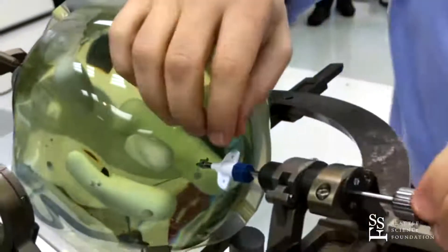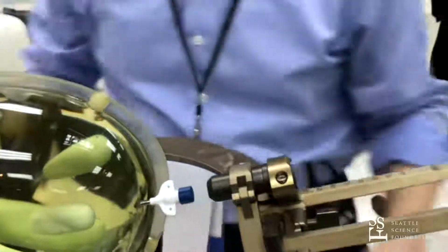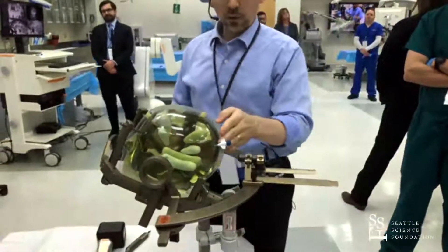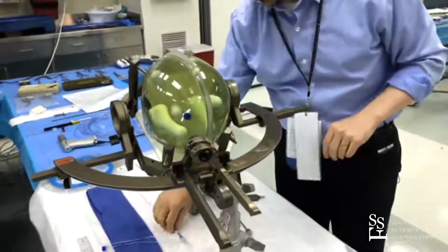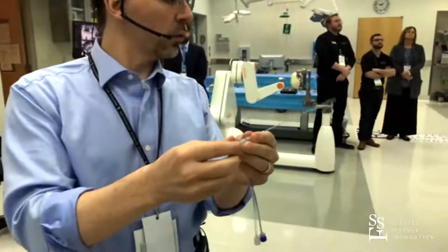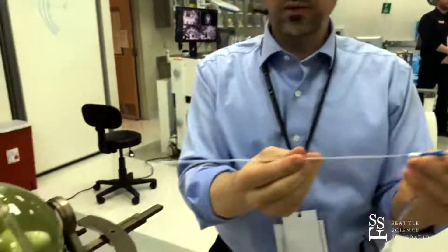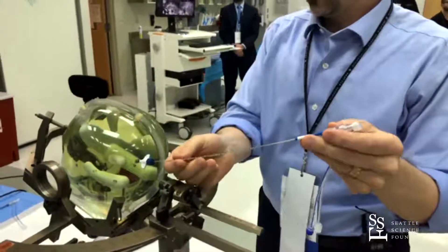If this is a real head, usually about 10 good turns is sufficient to make sure you're through the skull and it's well secured. Once satisfied, the alignment rod and reducing tubes can come out. We can move the arc out of the way, and then calculate from the frame to the depth of our target. This is the Visualase cannula — a plastic hollow tube with a stiff aligning rod in it, not dissimilar to the aligning rod we used to put in the bolt. Once we've measured the depth we need from the top of the bolt, we can introduce this into our target.